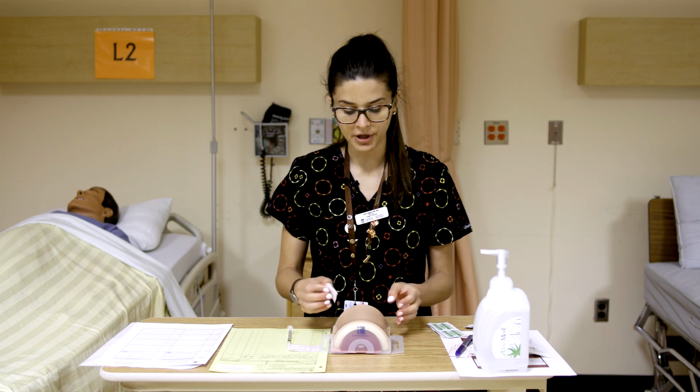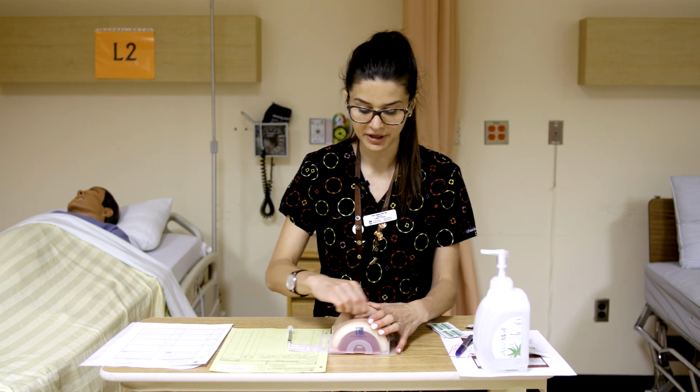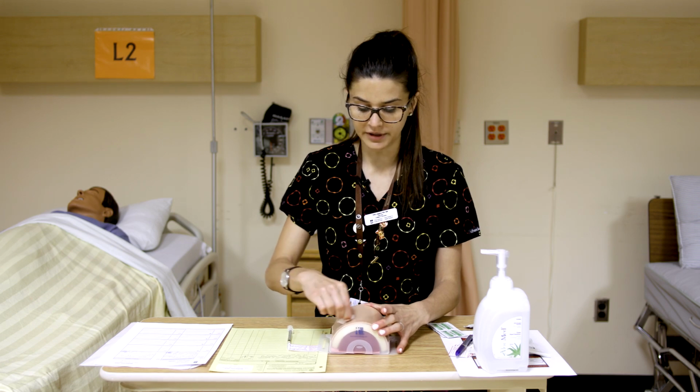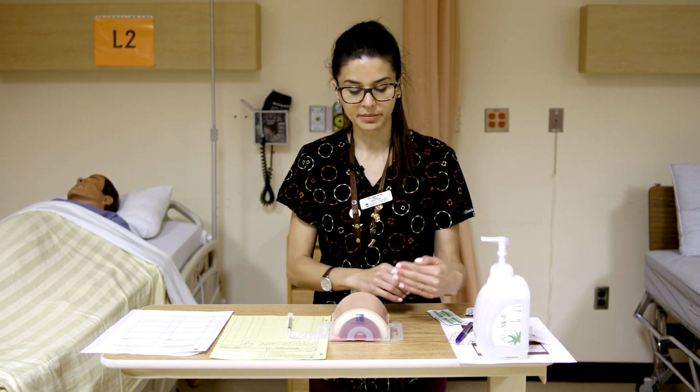So for intradermal, the most common site, and we're going to clean it. We're going to clean in a circular motion. I just want this to dry while I talk. So we're going to clean in a circular motion, starting in the center and working our way out of the selected site for 15 to 30 seconds. And then you're going to want to let that dry completely.